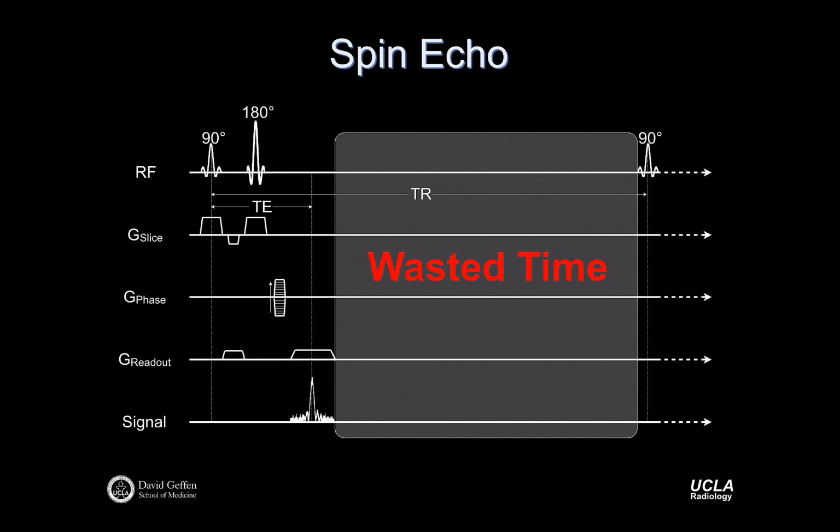Nevertheless, because we're waiting during this interval for magnetization recovery, MZ is just growing back this entire time. Transverse magnetization is just decaying the entire time, and for whatever contrast we were trying to get, this is the chosen TR, and this looks in some sense to be wasted time, except that there's magnetization recovery. So the question is, could we be doing something else? Fine, the magnetization needs to recover, but could we be doing something else during this wasted time? And of course the answer is yes.